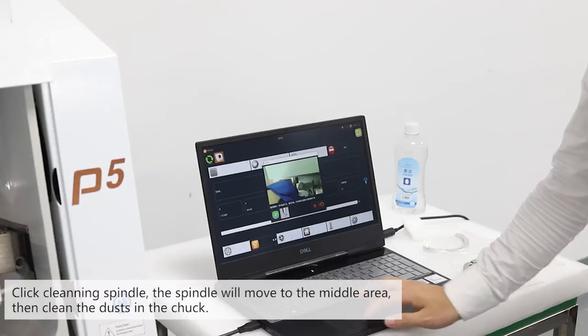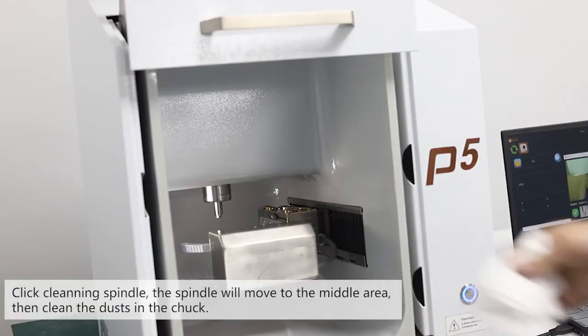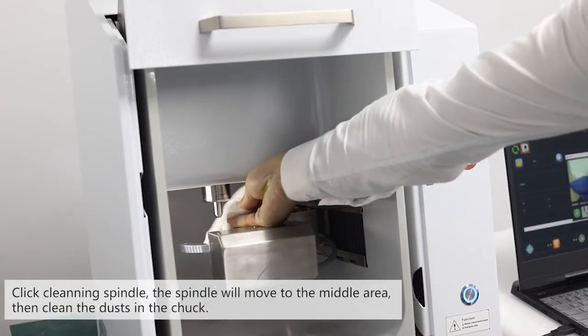Click cleaning spindle. The spindle will move to the center area. Then clean the dust in the chuck.